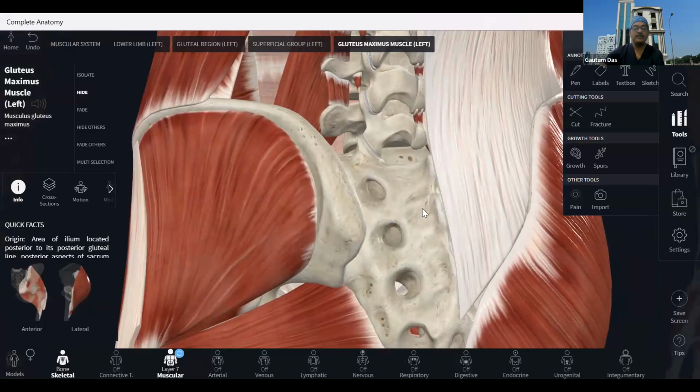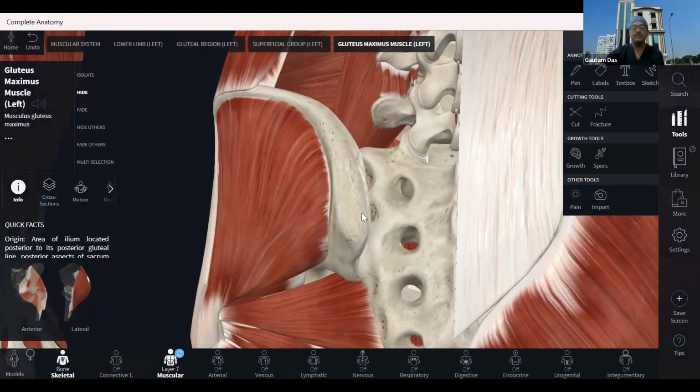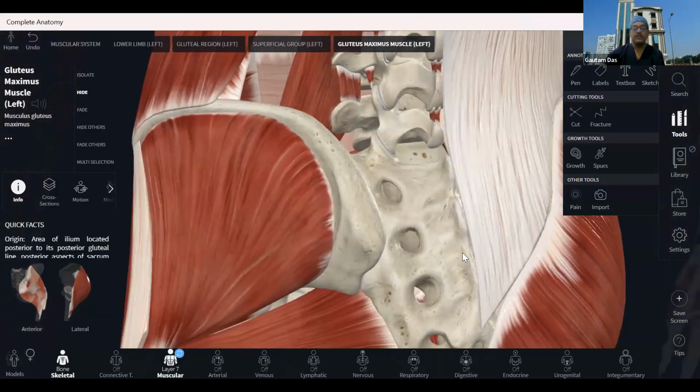After that, this is a lamina, then the foramen, and then there is another elevation. This is known as the lateral sacral crest. And then comes your sacroiliac joint, and then comes the iliac bone, posterosuperior spine. So posterosuperior spine, then the SI joint, then the lateral sacral crest, then lamina or foramen, and then most medially is your, what is this called?